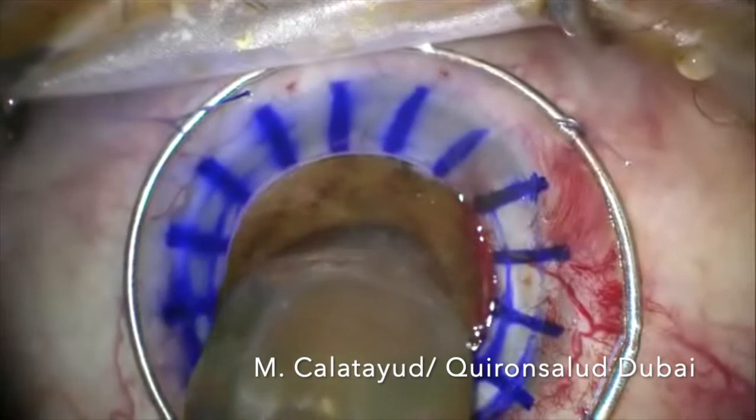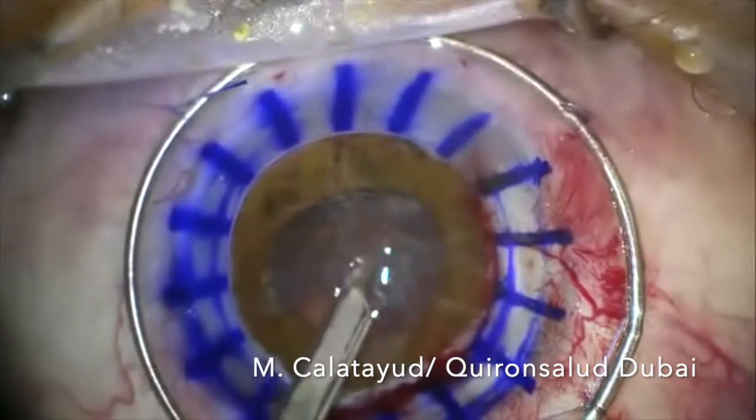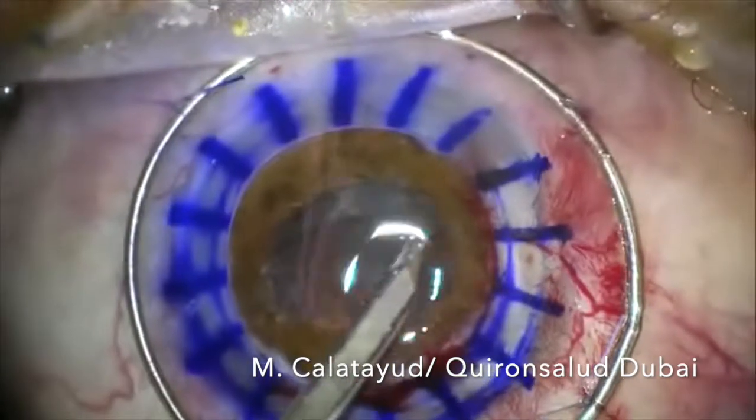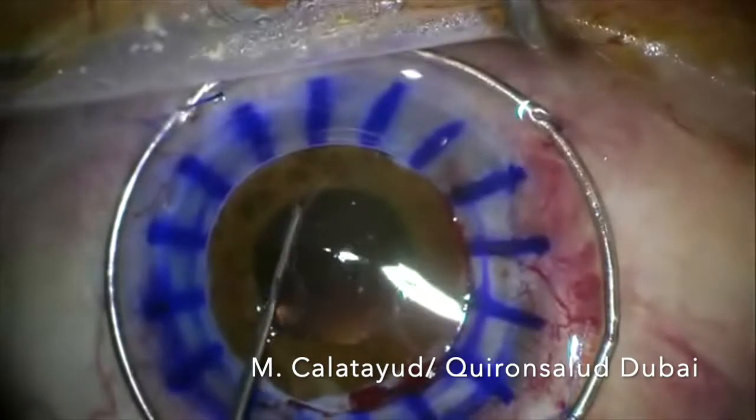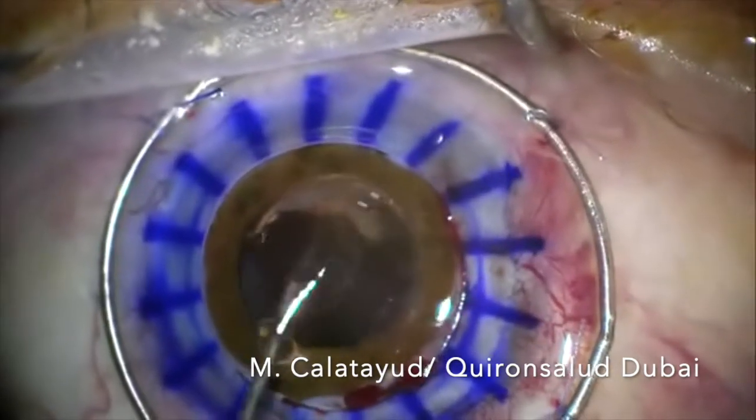In these cases, all the movements should be very, very soft. We remove the remaining cortex with the Simcoe cannula, and then we fill the bag with viscoelastic and implant a lens into the bag.